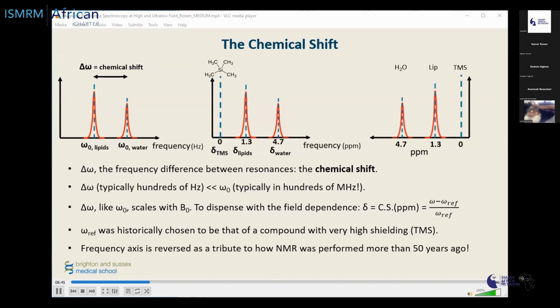Another historical note is that when we represent those spectra measured, for example, on the scanner, or when we prepare our graphs to be sent for publication, we flip the axes. Instead of going from left to right, they actually go from right to left. We don't have enough time to explain why it is done this way, but it is a convention where we will see that the numbers increase in ppm, and essentially in resonance frequency, going from right to the left.